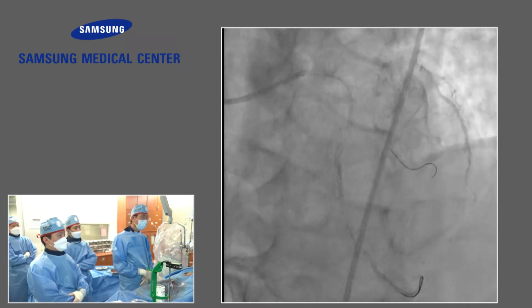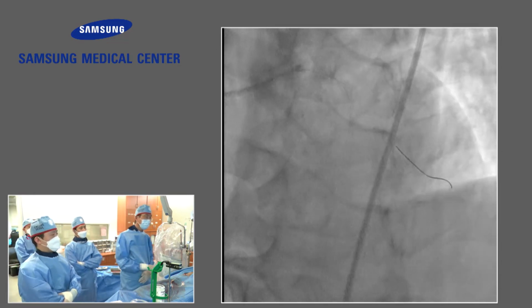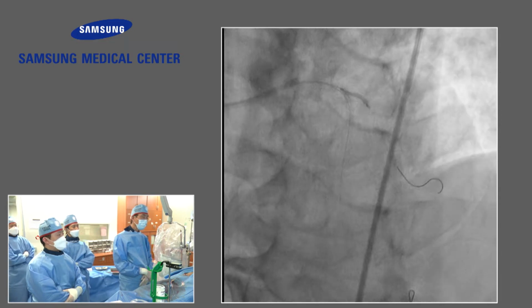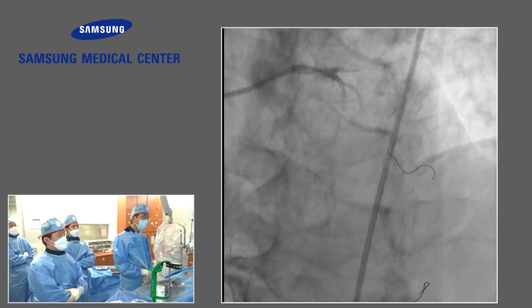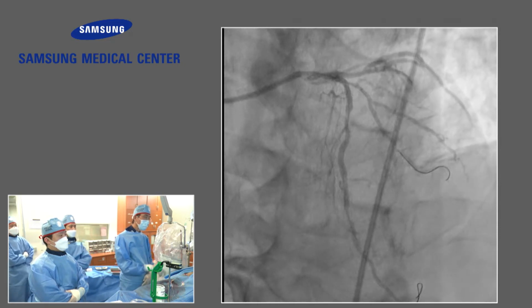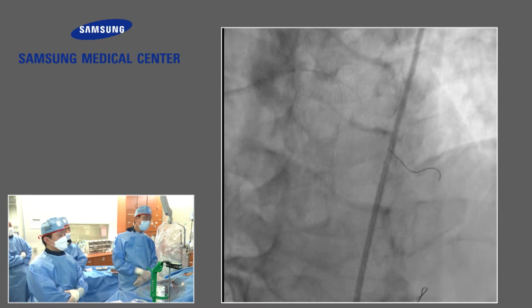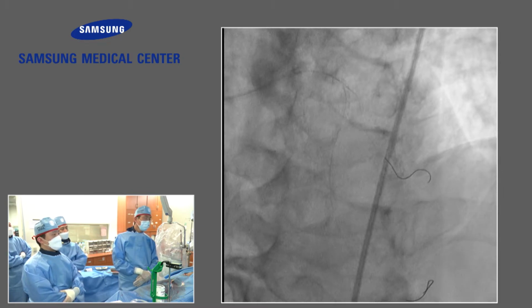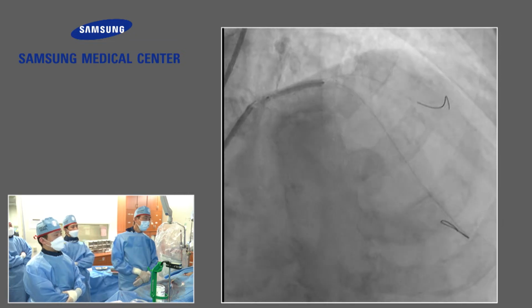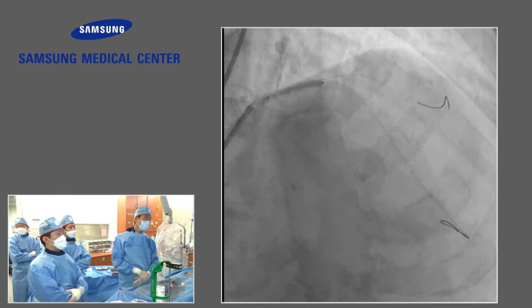So angiography with wire, the flow was delayed. Next. So we dilated very slowly with the 2.0 balloon again. Next. The flow was improved, but still we have about 70% residual stenosis. The option now is kissing ballooning, next, but I prefer repeat with the same balloon. Next.